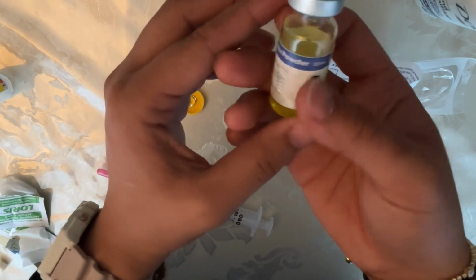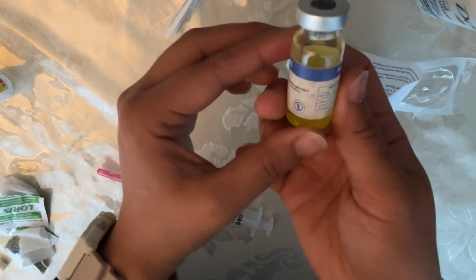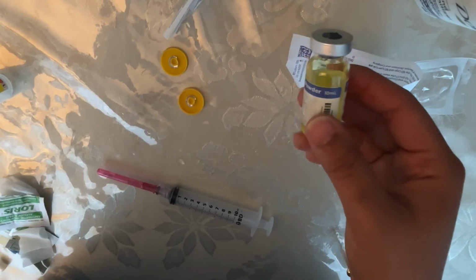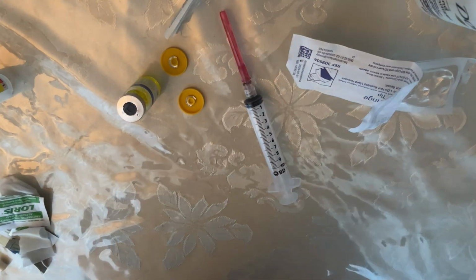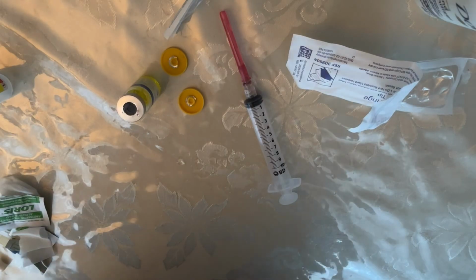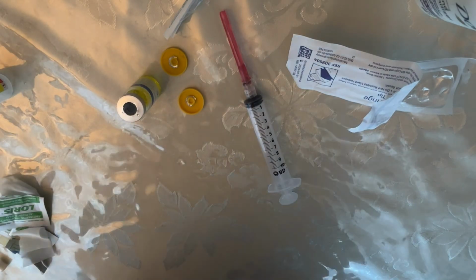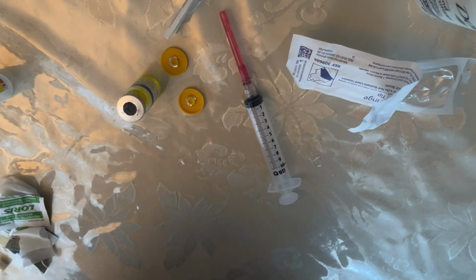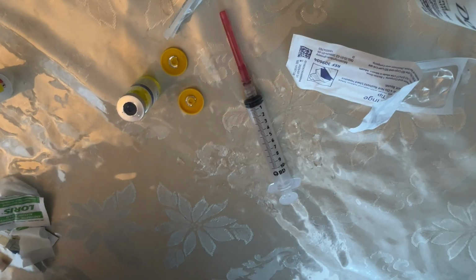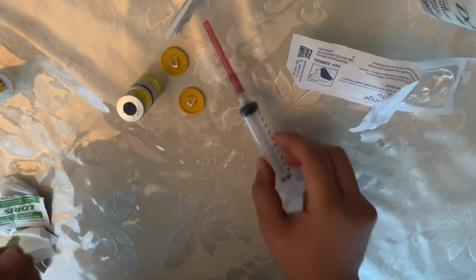dissolved and is fully incorporated, we are ready to withdraw the medication that we need, and we have to calculate for that. So again, our order is 0.5 grams or 500 mg, and after adding 7.7 ml sterile water, we have the final concentration of 500 mg per ml. So we did a calculation, and the amount desired that we have to withdraw is 1 ml of medication.